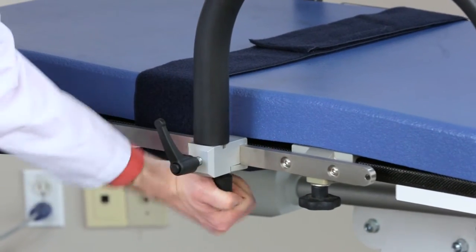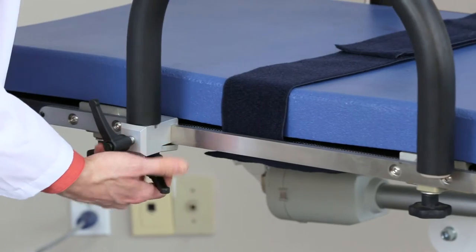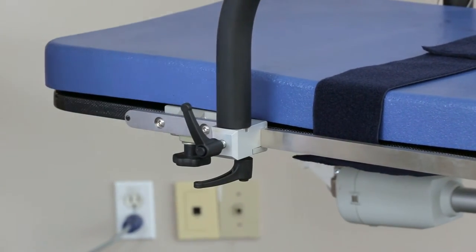To move the armrest, rotate the handle directly underneath it counter-clockwise. Slide it to the desired location, then rotate the handle clockwise to secure it again.